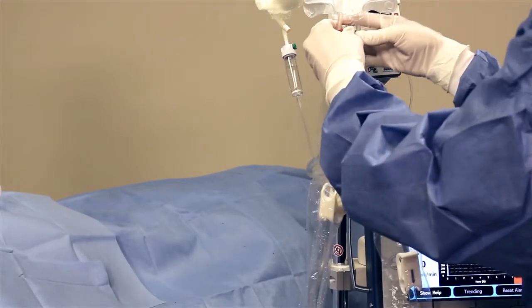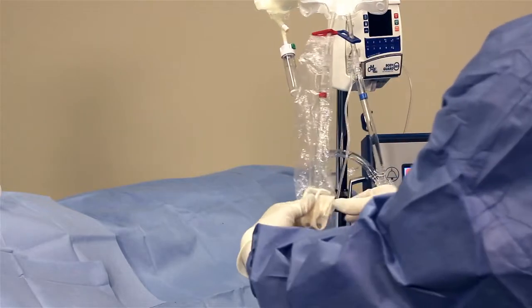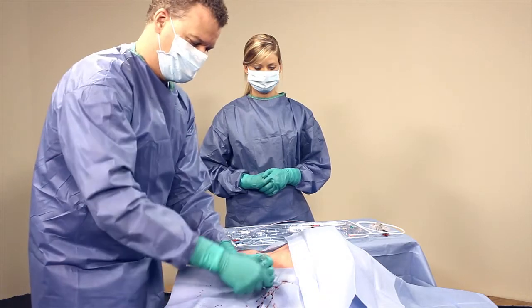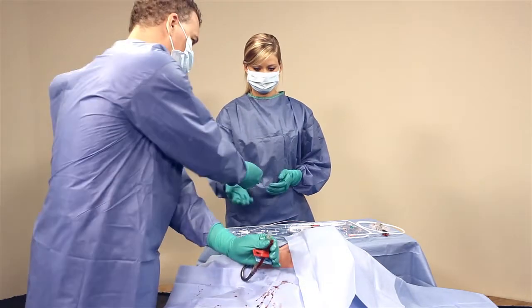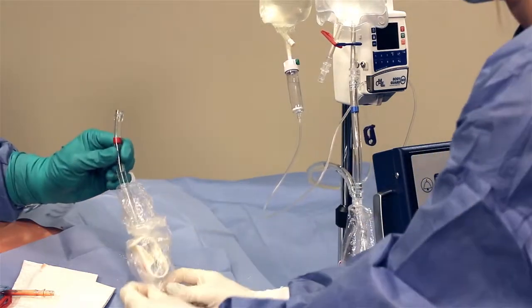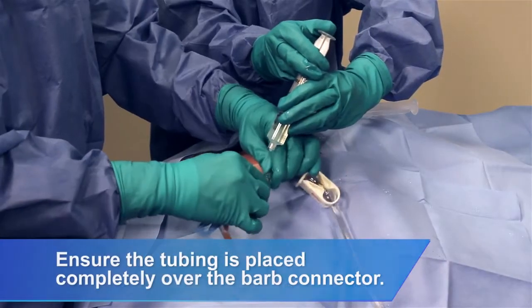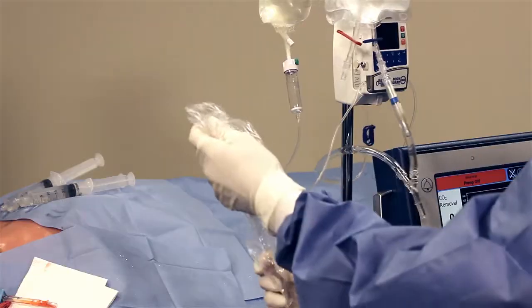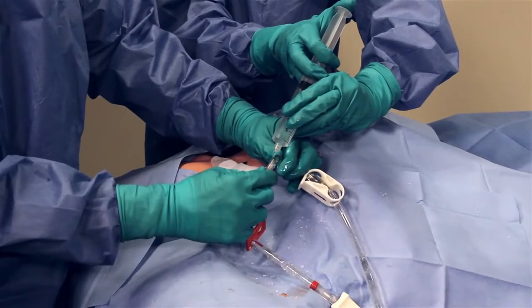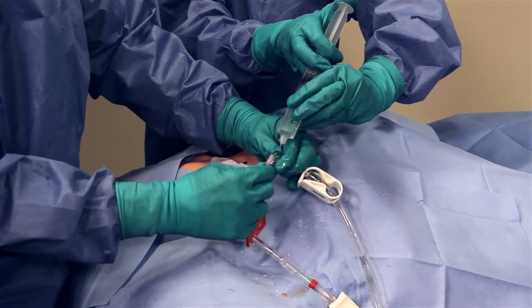Close all clamps in the circuit. Remove the priming adapters from each catheter lumen prior to connecting blood tubing. Disconnect the red tubing from the recirculation bag and connect it to the red lumen on the catheter using a wet-to-wet technique. Disconnect the blue tubing from the Y connector and connect it to the blue lumen on the catheter using a wet-to-wet technique.